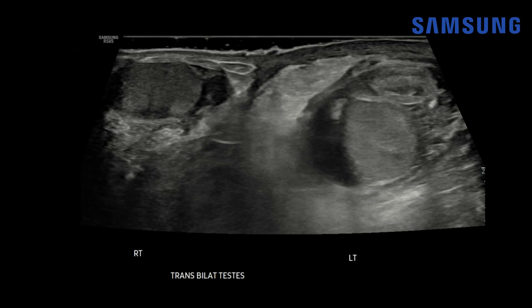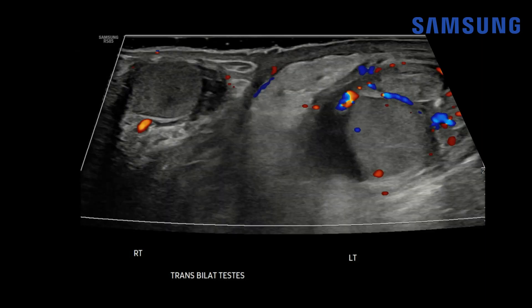Let's start with case one. This was an eight-year-old boy that presented with intermittent testicular pain for about three days. We're starting with a transverse view of the scrotum — there's the right testis and the left testis. Notice the left paratesticular tissues are heterogeneously echogenic. There's normal anterior right scrotal wall, but the left anterior scrotal wall is thickened. With color Doppler imaging, we can see there's hyperemia surrounding that left testis.